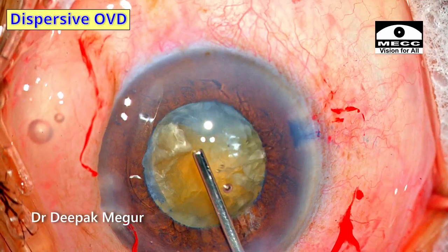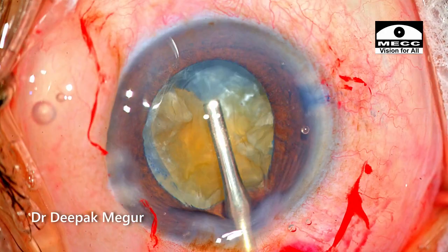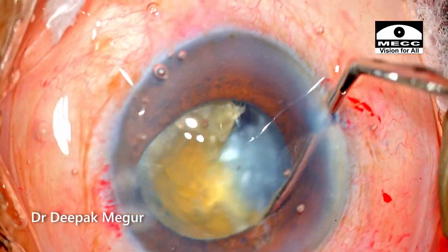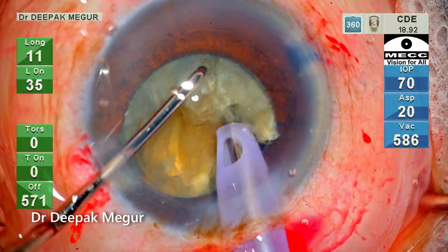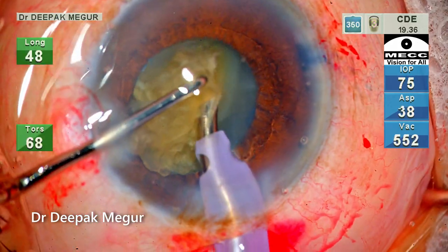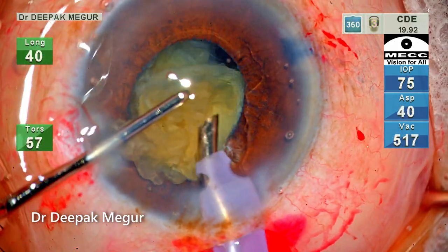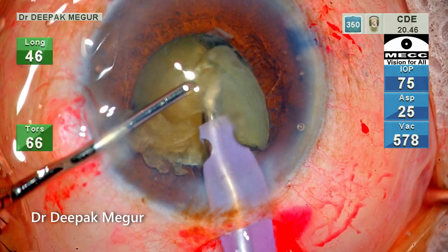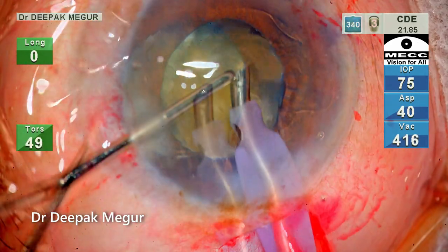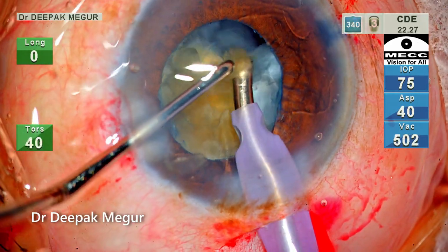OVD is replenished. First, the dispersive OVD goes in, followed by HPMC underneath it. The remaining heavy nucleus is being divided and the fragments will then be emulsified. The plane of emulsification is much more anterior than my routine cases because of the obvious reason that the rhexis is not continuous.